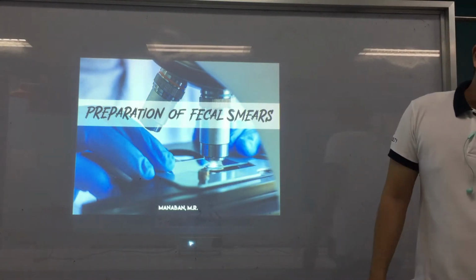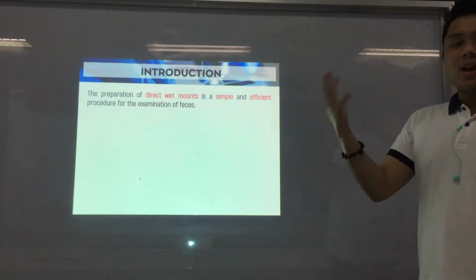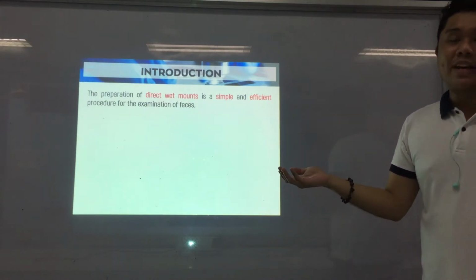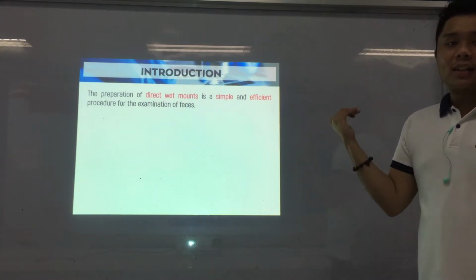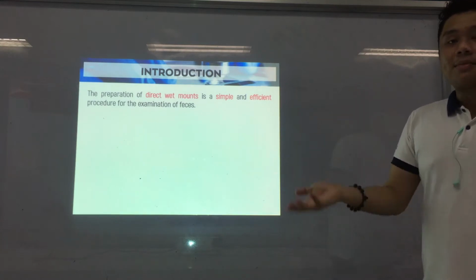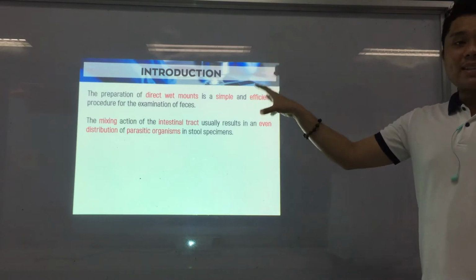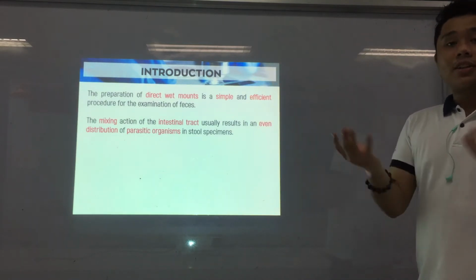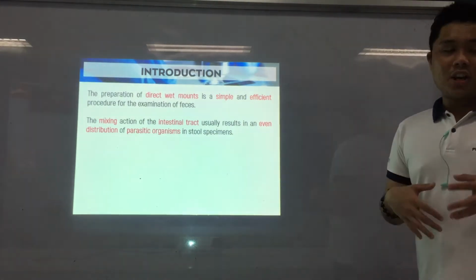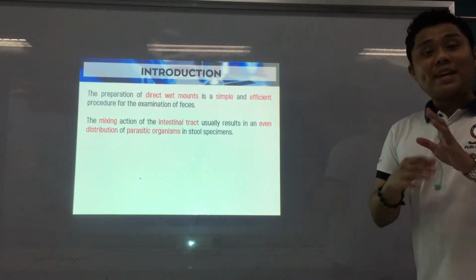Now for a short introduction, the preparation of a direct wet mount, okay, that's another term, wet mount, is a simple and efficient procedure for the examination of feces. Later I'll discuss what it means, but again, when you say direct wet mount, it is creating smears from your feces or stool samples. Because the mixing action of your intestinal tract makes the distribution of the parasites found in your intestines to be evenly distributed.